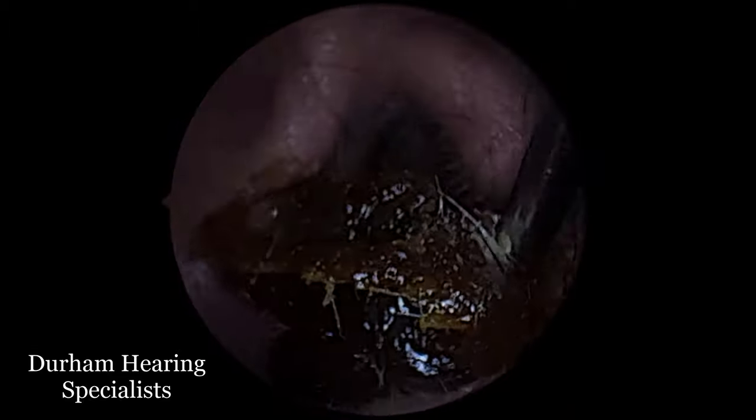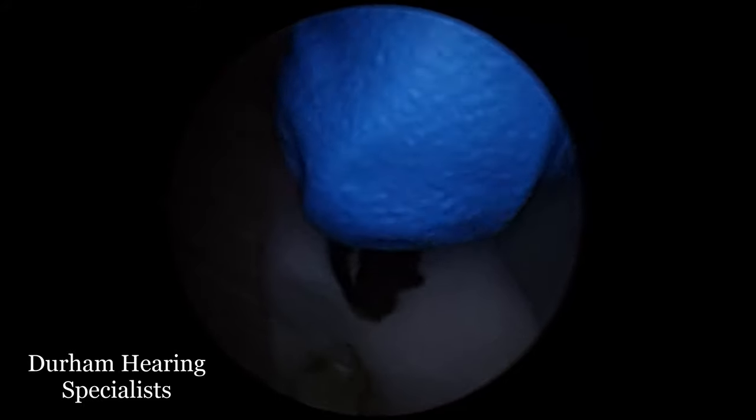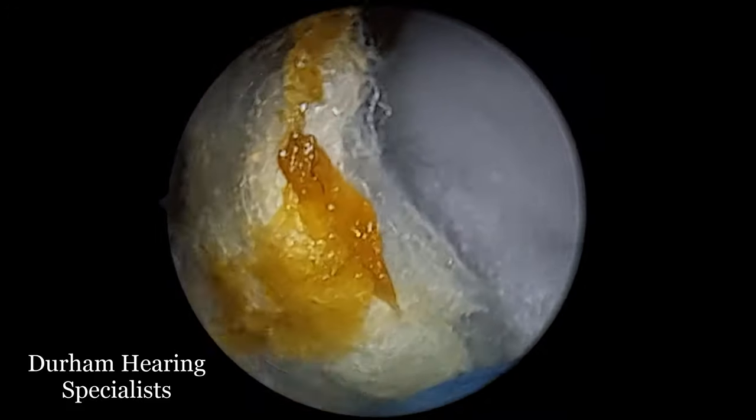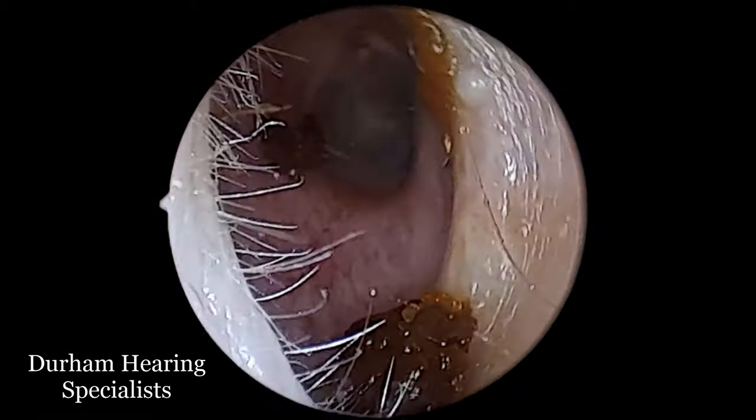And you'll see just as it's exiting out of the canal, it is a rather large dark oxidized piece of wax — and there we have it. So that coupled with the cotton wool plug is a rather extensive blockage in the ear. You can see there's also a little sheet of dead skin on that earwax mass, and what we're left with is a rather clear ear canal.